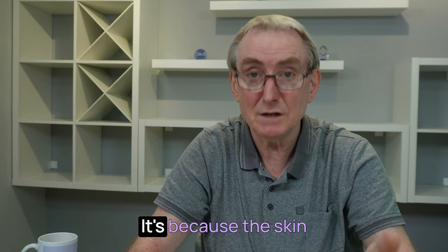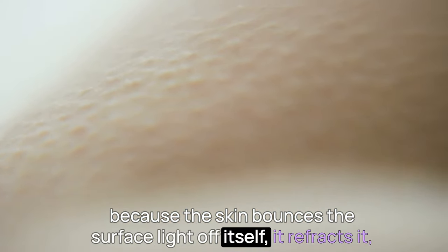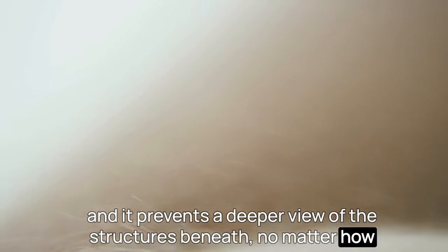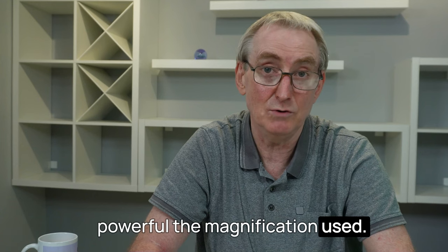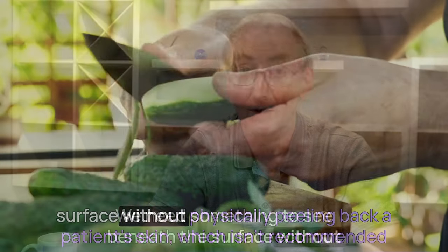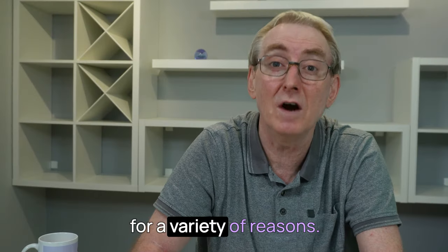But there's a problem when it comes to skin. It's because the skin bounces the surface light off itself — it refracts it — and it prevents a deeper view of the structures beneath, no matter how powerful the magnification used. We need something to see beneath the surface without physically peeling back a patient's skin, which isn't recommended for a variety of reasons.